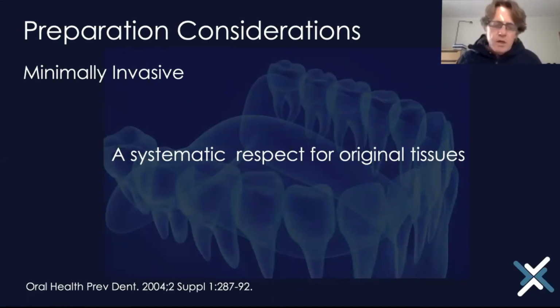If you are going to work in ceramics, I hear all the stories about people saying, oh, you don't have to prepare and you can do prep-less veneers. There's also lumineers. You might remind yourself that about 2 or 3 years ago, there was a lot about veneers that were so thin that you had to use a refractory model to make them. I've noted personally that whole discussion has gone very quiet. And you know, when discussions go away, there's generally a problem with them.